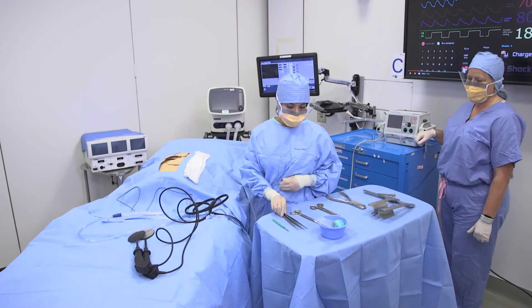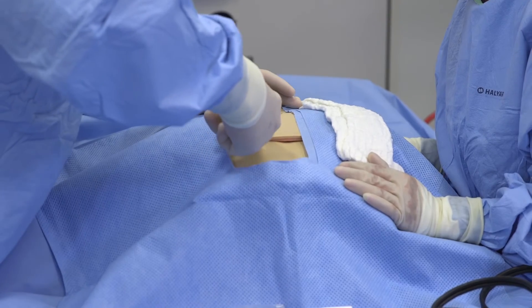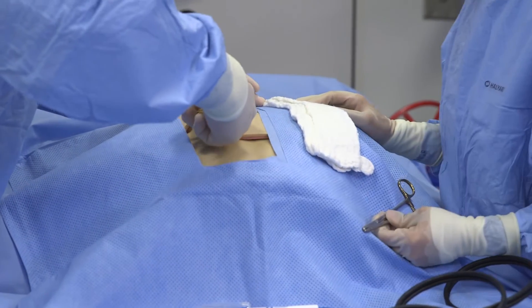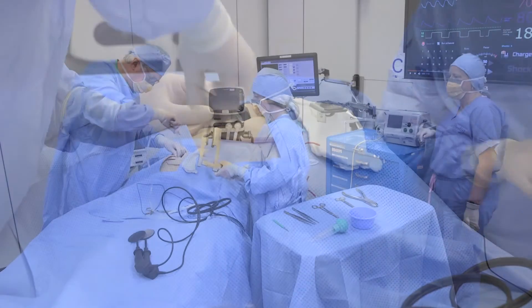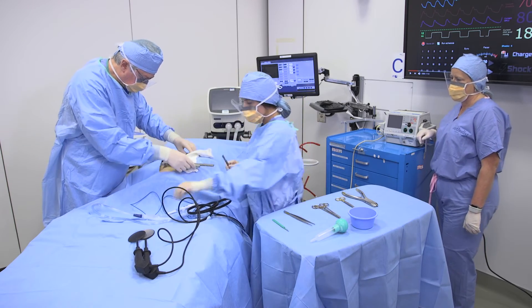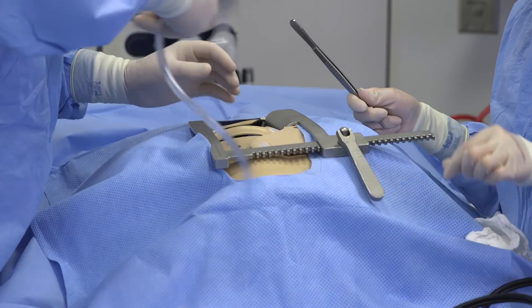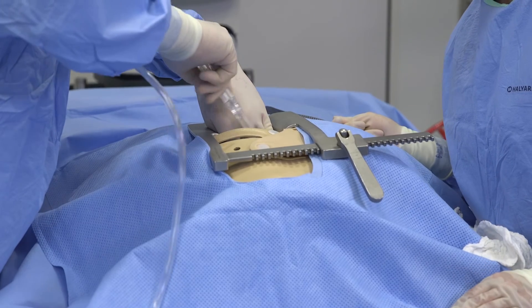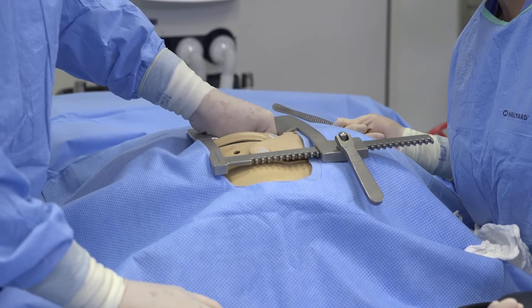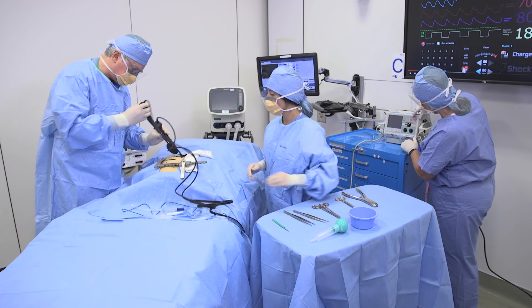When the surgeon enters, a sterile team member will give him the scissors or scalpel and will assist in cutting the wires. A retractor will be used to open the chest and visualize the heart. Once the heart is visualized, sterile suction will be utilized to visualize the graft sites. At this time, the surgeon may perform cardiac massage and use the internal defibrillator paddles, shocking at 20 joules.